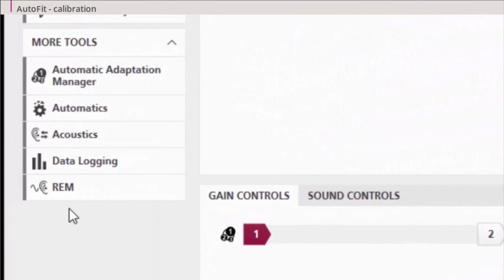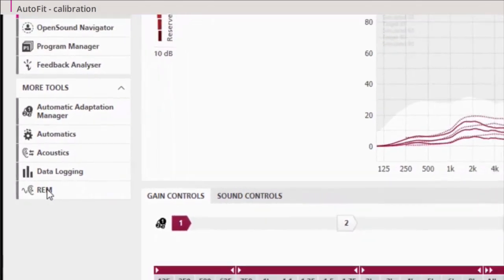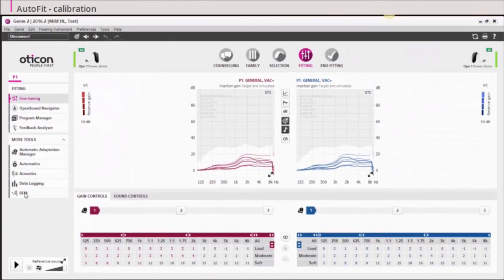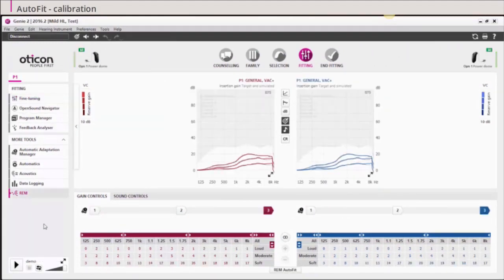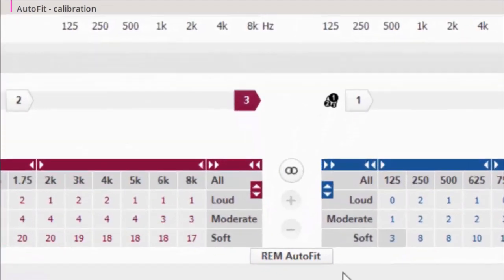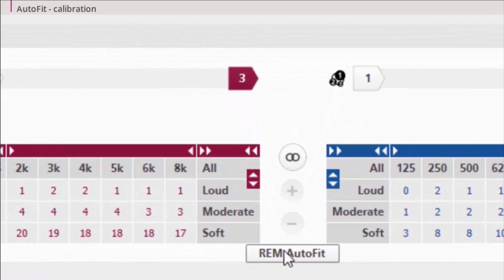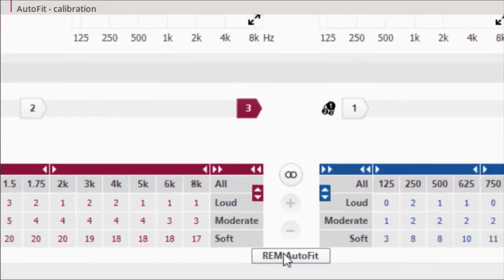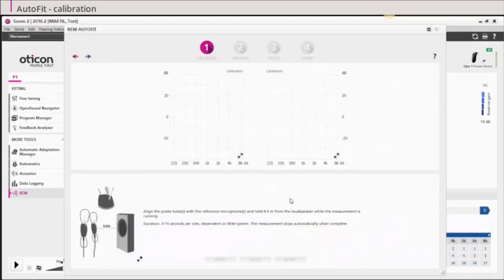To perform REM AutoFit, select REM under More Tools. In the REM tool, automatic features will be switched off during the measurement. On the REM screen, click REM AutoFit to open the tool.